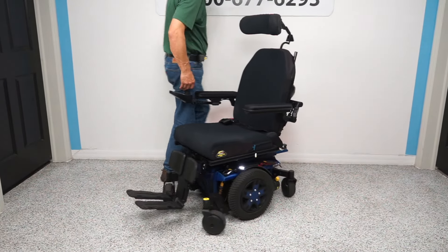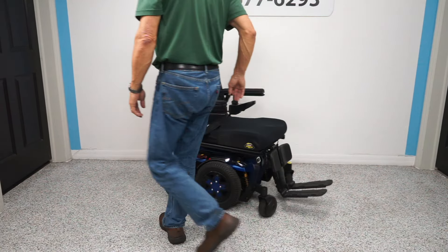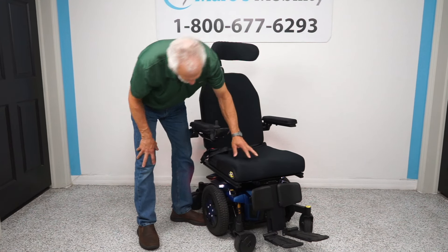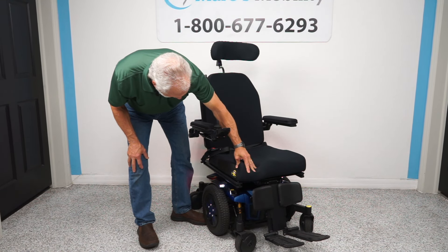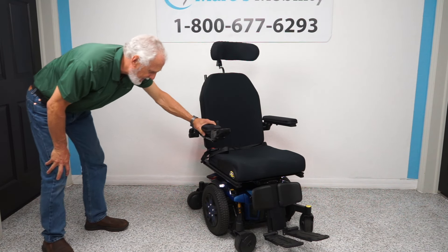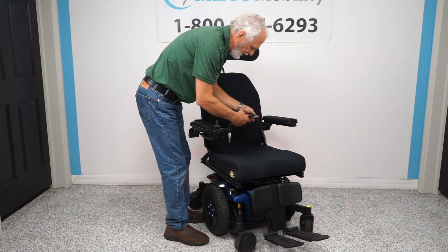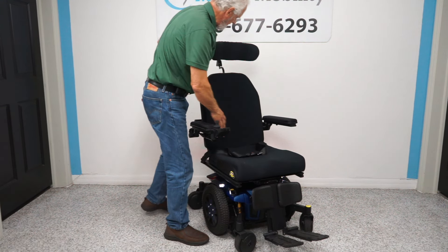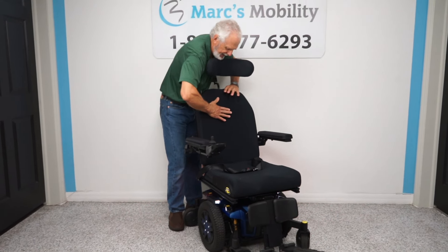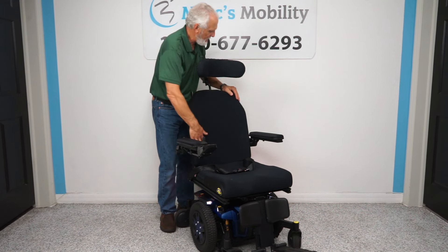This chair has a 20-by-20 Spectrum Stealth Products Essence cushion, which has a little bit of memory foam — a super nice cushion. There's also a safety belt. The back is memory foam, so when you lean back your body pushes into it and it contours to your body.